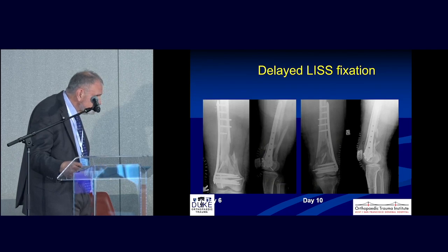And even an integrated plate system on that now. So I think that is an option. And my understanding of the current literature is that the results are fairly comparable. I've used it in people with bad skin wounds, elderly patients who are looking for a less invasive procedure.